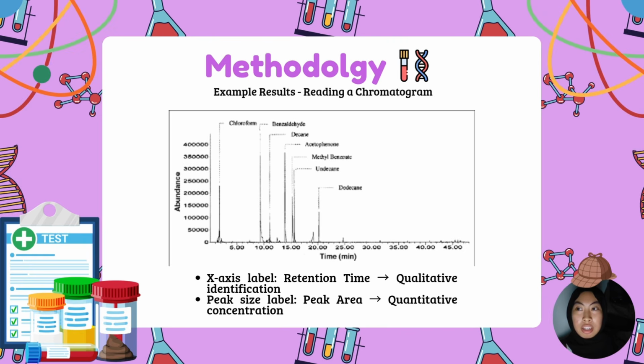Second, peak area. The bigger the spike on the graph, the higher the concentration of the poison in the system. Pairing this with a mass spectrometer gives us an undeniable chemical fingerprint. The ultimate gotcha moment in a forensic lab.